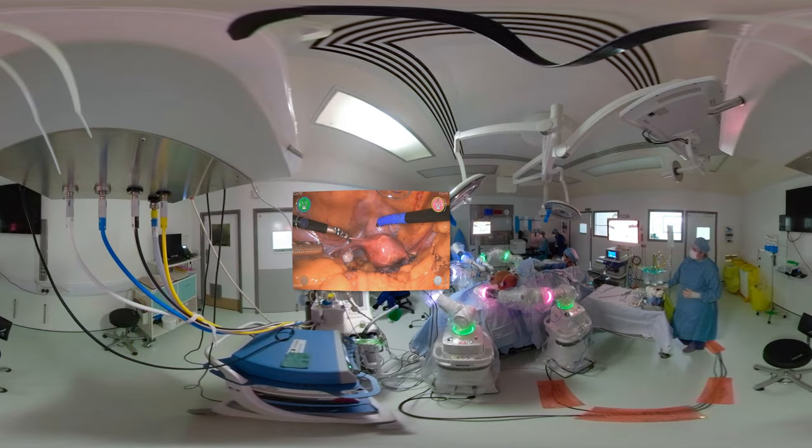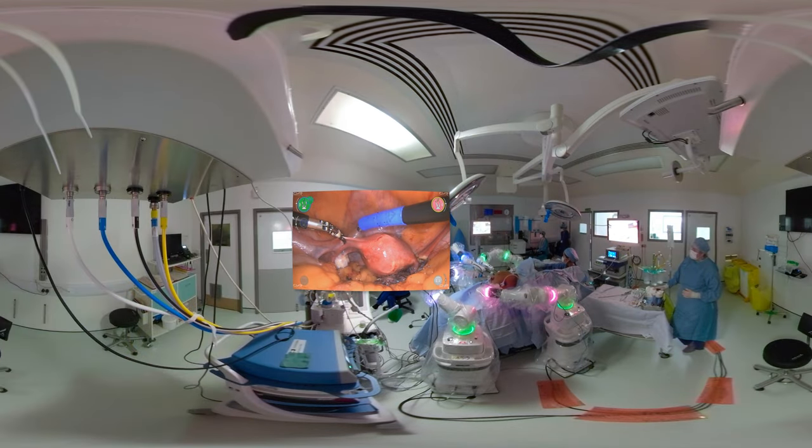Again to give you an overall view, here's the theatre setup. There's an assistant at the bottom manipulating the uterus and the robotic arms are at play.